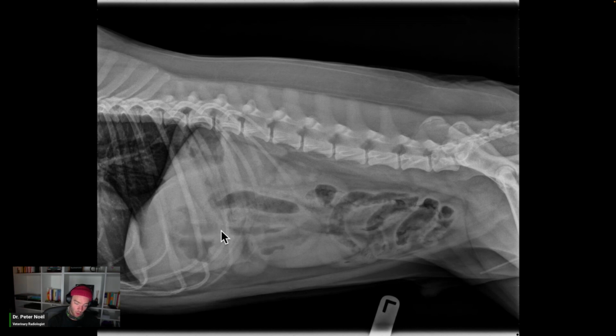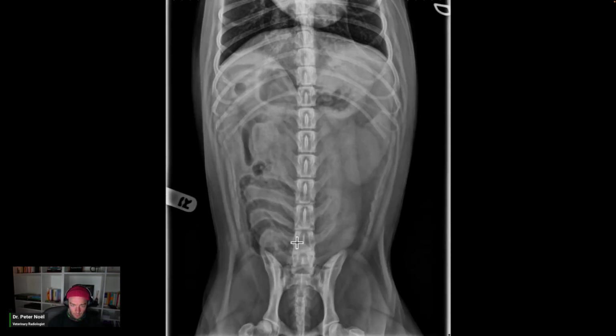And so maybe start with the left lateral view. Graeme asked for any landmarks for the cranial limit of the colon. On ultrasound, what you'd find is that it shouldn't... Some of the caveats to this is if you have a redundant colon, sometimes you can have a lot of excess colon. Sometimes cats will have a short colon syndrome. There's not a lot reported on it, but sometimes it's with chronic GI disease. You run up the colon and the ICJ is like right here and you're like, well, that's not normal. But I think in the normal patient, the cranial limit kind of butts up against the stomach. You shouldn't see it coming way up here. So the colon should come up here and it should kind of arc around here.